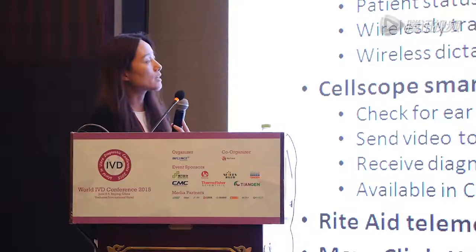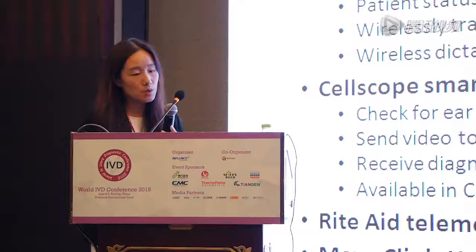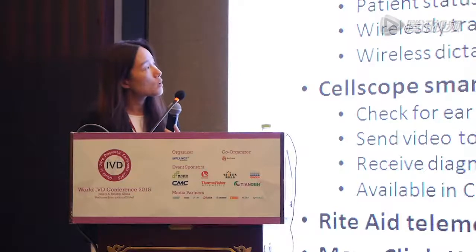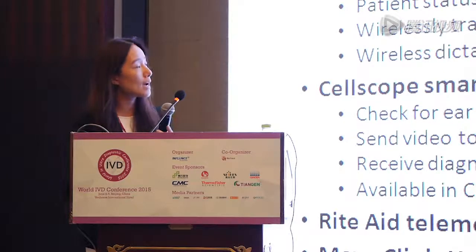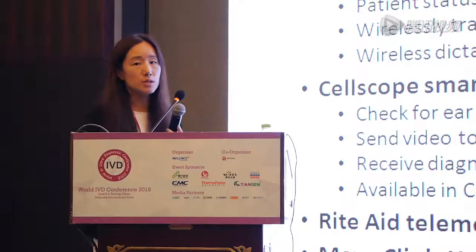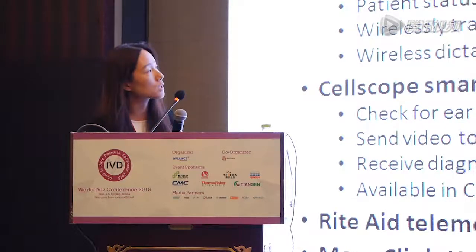And what I find really attractive is a device called the CellScope smartphone otoscope. This is essentially a point of care device that you can attach to any of your smartphones. Any of us with small children know that one of the big risks in small children is ear infection. When they're young, they're very prone to ear infections. And when that happens, you have to know whether there's a bacterial infection. And if so, antibiotics should be given very quickly, which will control the infection very quickly.